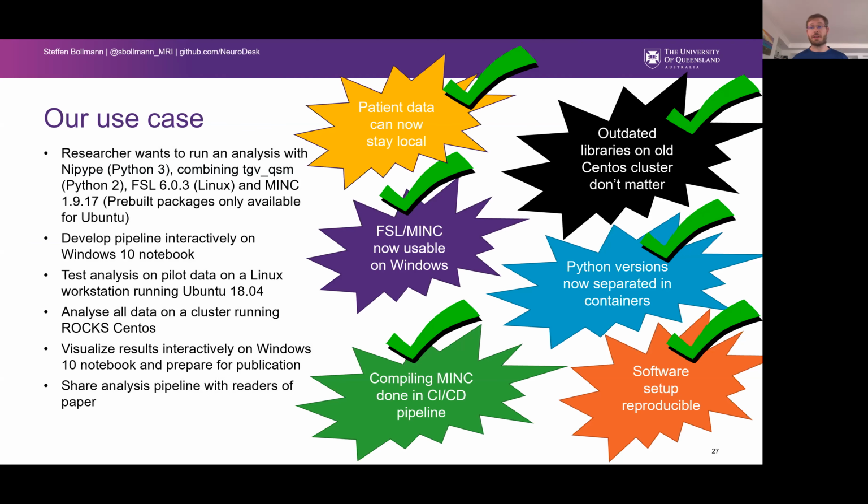And a new use case that we discovered while developing this is that now patient data can stay local. We don't have to transfer our patient data to a remote system to analyze it. We can actually leave it on that system. And that opens up completely new use cases for analyzing neuroimaging data in a healthcare setting.